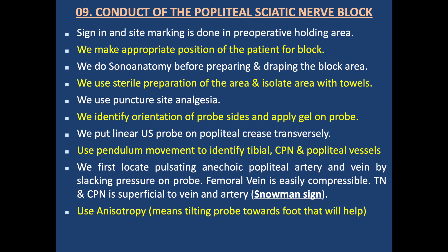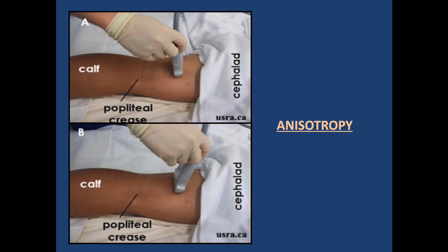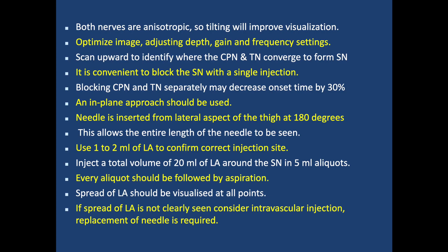The femoral vein is easily compressible. The tibial nerve is superficial to the vein and artery. The common peroneal nerve lies lateral. We use anisotropy — tilting the probe towards the foot — which will help improve visualization, as both nerves are anisotropic. We optimize the image, adjust depth, gain, and frequency settings. We then scan upward to identify where the common peroneal and tibial nerve converge to form the sciatic nerve. It is convenient to block the sciatic nerve with a single injection.